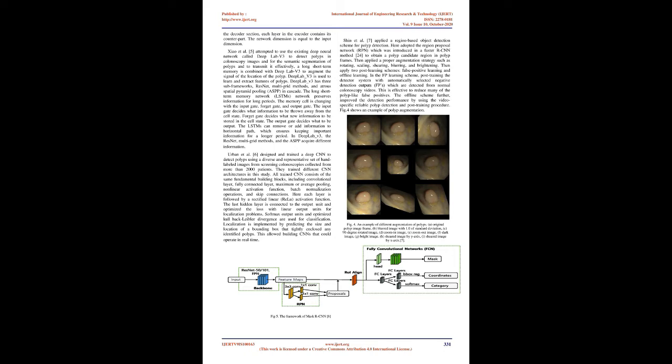Et al. 3 presented another novel hybrid classification method for automatic polyp segmentation in colonoscopy video frames. The segmentation method is composed of 2 main stages: the region proposal stage using the FCN, and the region refinement stage using texton-based patch representation followed by a random forest, RF, classifier. FCN provides initial polyp candidates, and texton-based patch representation further discriminates polyp from non-polyp regions. Data-driven and hand-designed features are taken for segmentation. Moreover, the hierarchical features of polyps are learned by FCN, while the context information related to the polyp boundaries is modeled by texton and patch representation.